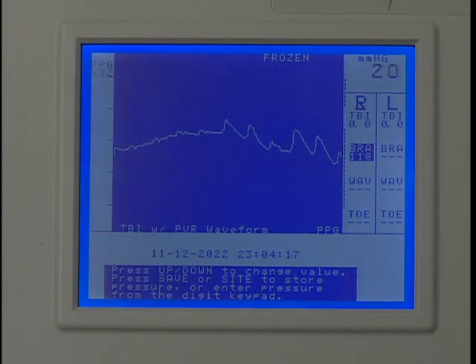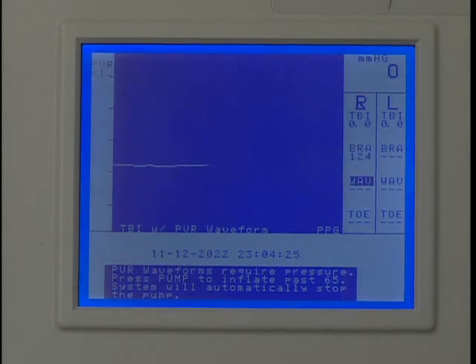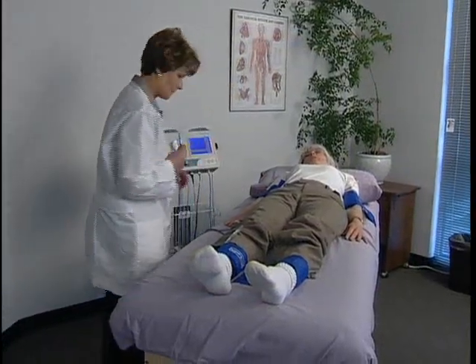Press the up or down key to move the caliper tool to the beginning of the first upward slope at the start of the pulsation, as shown. This is the systolic pressure. Press Save to record it, and the marker will move to the next protocol location. Now we'll obtain the waveform using PVR.